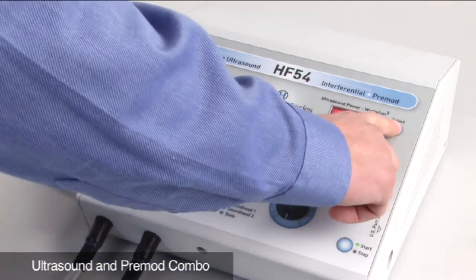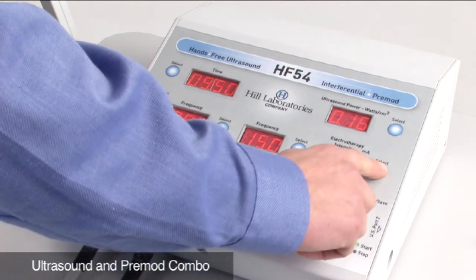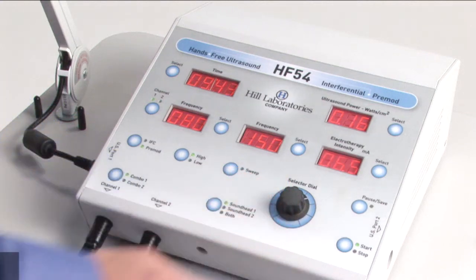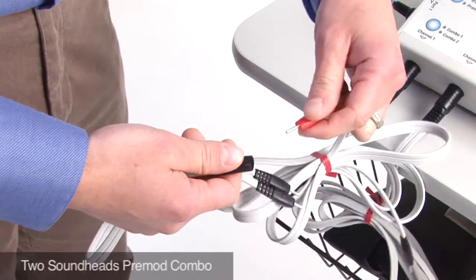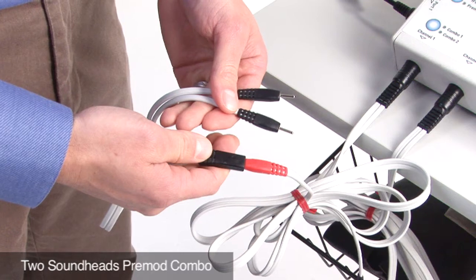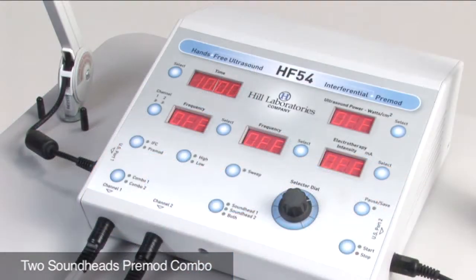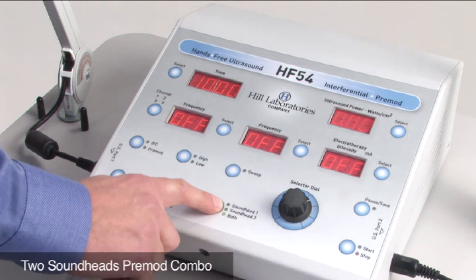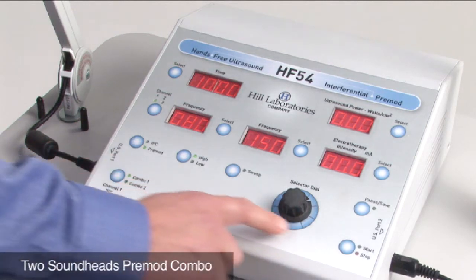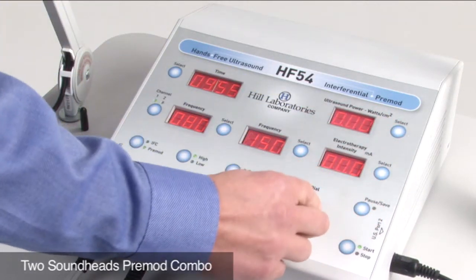Set your ultrasound power and set your electrotherapy intensity. If you want to perform combination with two sound heads, first attach the provided splitter to the red lead wire of channel one. Position both electrodes with a surface area equal to or larger than the sound heads. Select both sound heads combo one and press the start button. Increase the ultrasound power and increase your electrotherapy intensity.